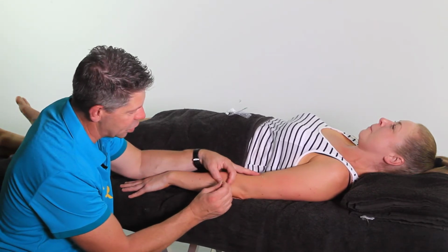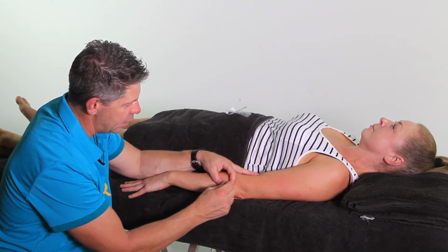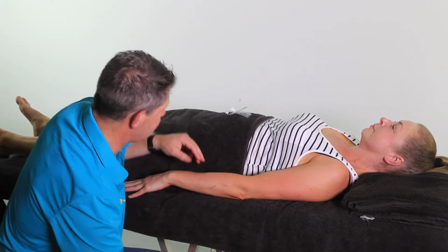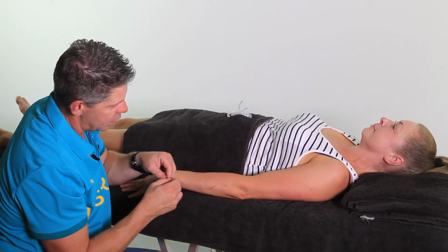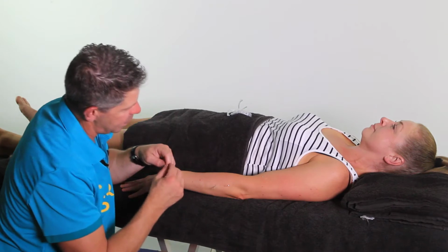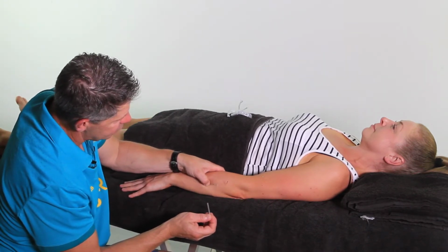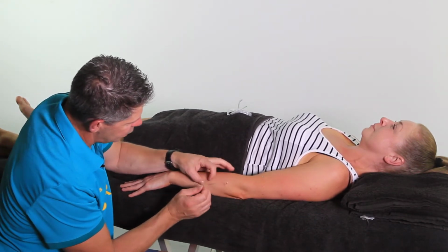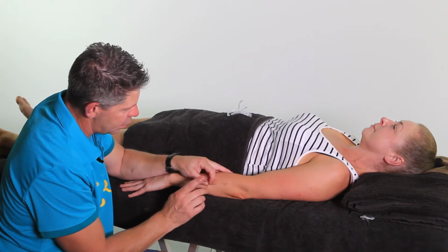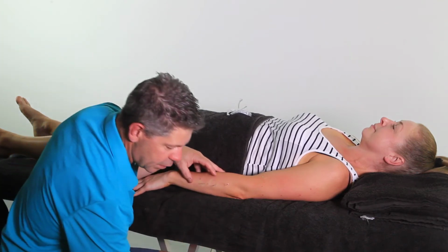So I'm going to come short just the musculotendinous junction, once again, like so. And then we're going to come a little bit third inferior down from the main trigger point. So just through here. Tender there, Ali? Yep. Back. So once again, in. Okay. So that's all we need to do.